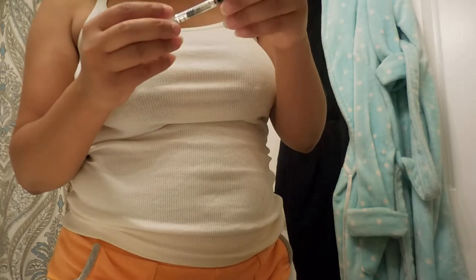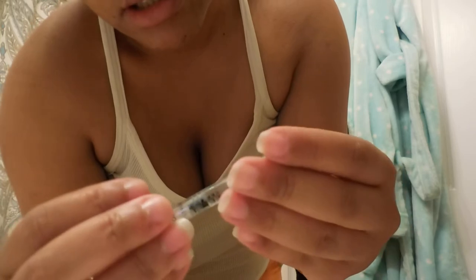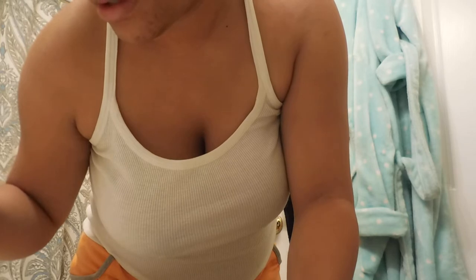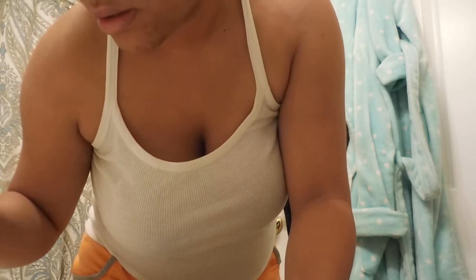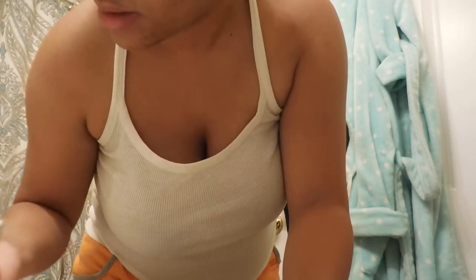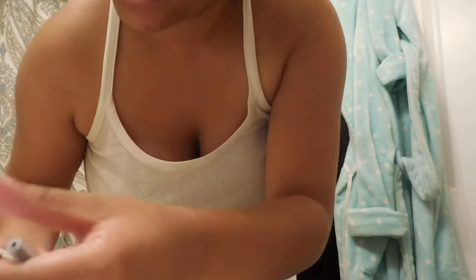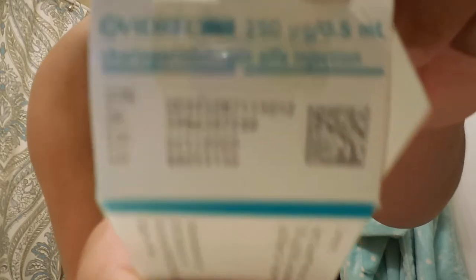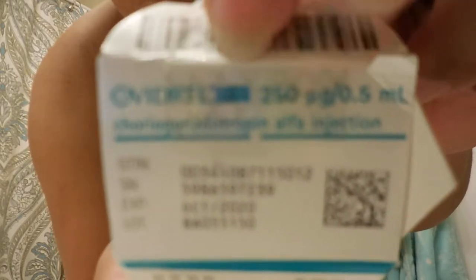How many milliliters is this? It doesn't say... honestly it looks like about 0.5 or 1. Oh yep, 0.5 — it says it right there. I don't know if it's backwards to y'all, but it says 0.5 right there.